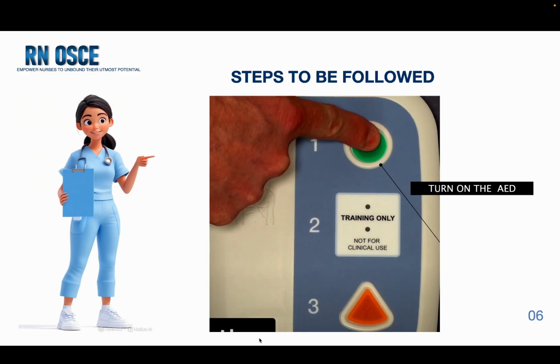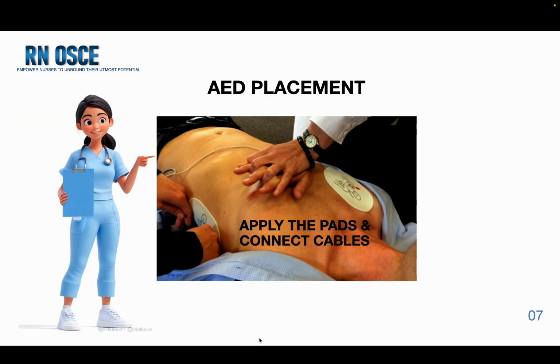You will hear accordingly: apply pads to patient's bare chest. Plug in pads connector next to flashing light. Once you turn on the AED, you will hear the audio prompts like apply the pads and connect the cables.